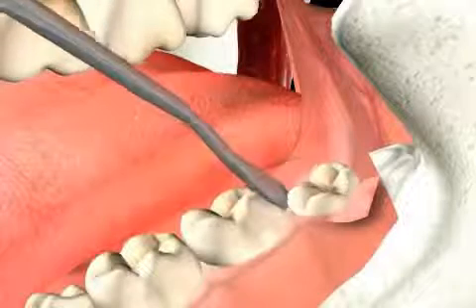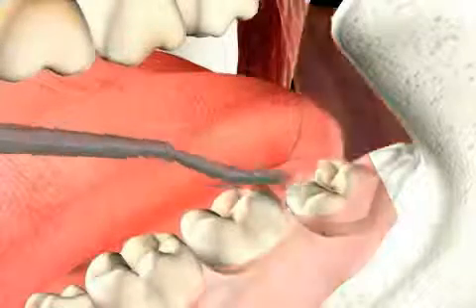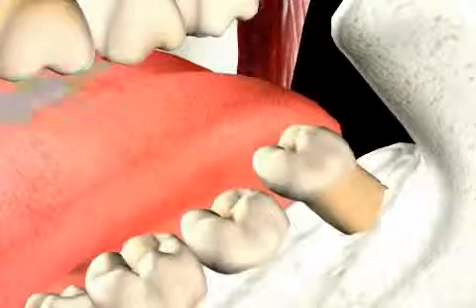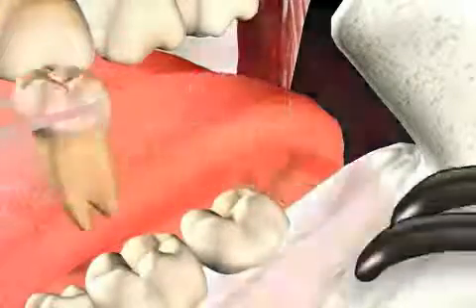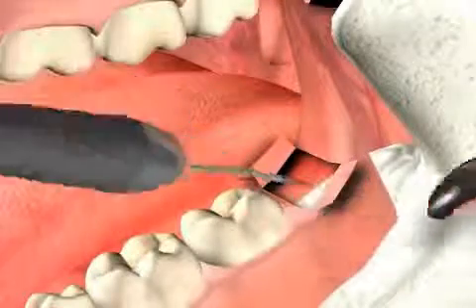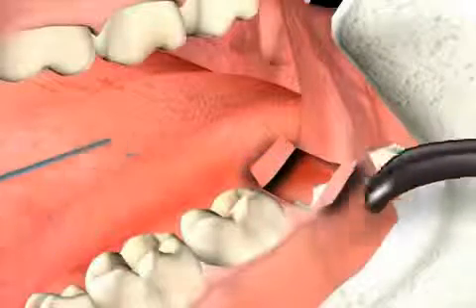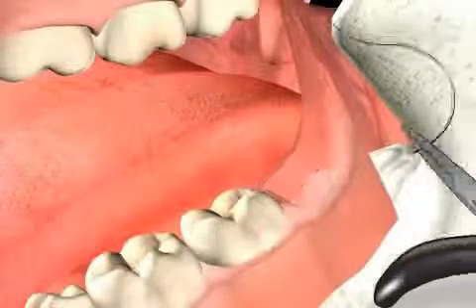As soon as the bone is exposed, the instrument is changed. Now the tooth is dislocated with the turning tool and removed as a whole. Any bone chips are rinsed off, and the dental follicle is removed as well. Wounds in the mouth heal from the inside out, so you don't have to worry about a hole remaining or food scraps that might become ingrown.